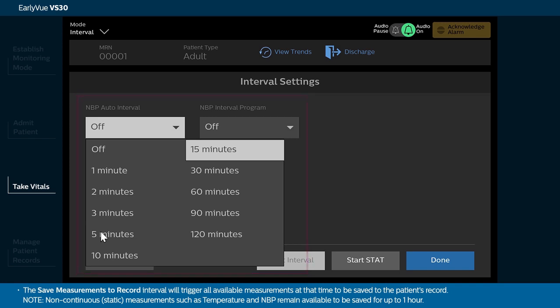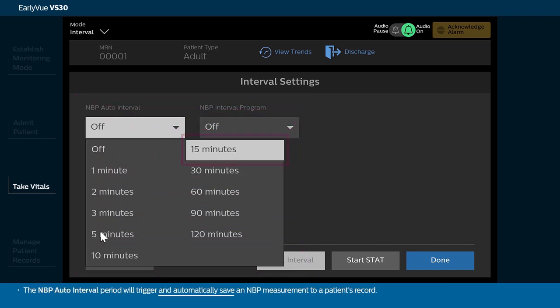The Save Measurements to Record interval will trigger all available measurements at that time to be saved to the patient's record. Note, non-continuous or static measurements such as temperature and NBP remain available to be saved for up to 1 hour. The NBP auto interval period will trigger and automatically save an NBP measurement to a patient's record.